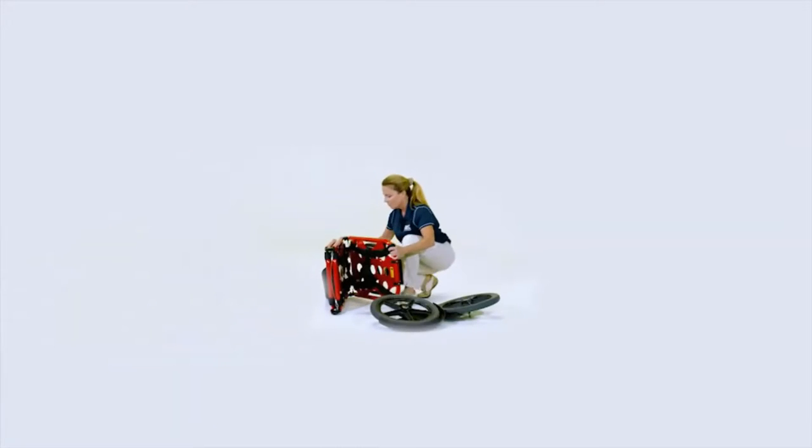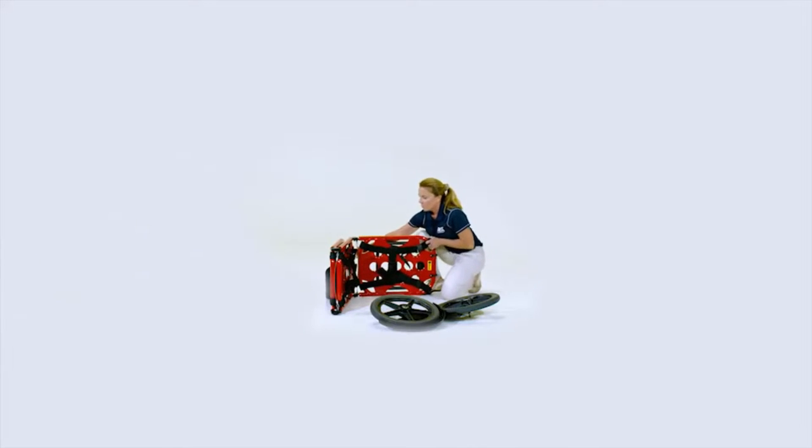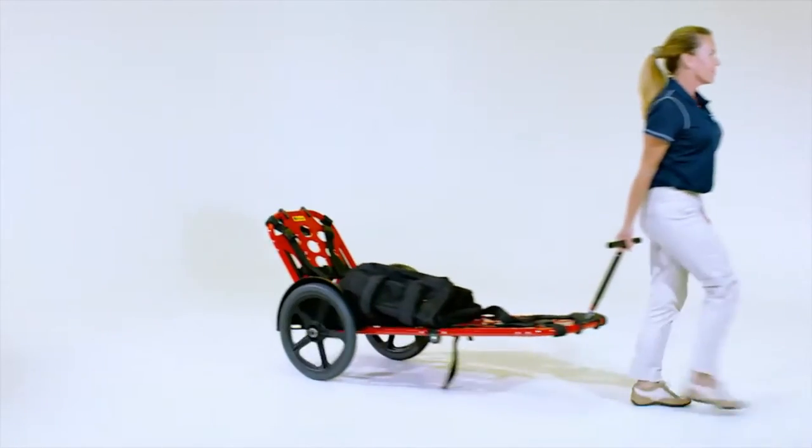The potential for back injuries is great on any event. Anything that could lessen that, I'm all for. This is the thing that I would use. The Rex takes less than 30 seconds to assemble. It's manufactured out of T6 aircraft aluminum, weighs less than 34 pounds, but is designed to hold up to 400 pounds.